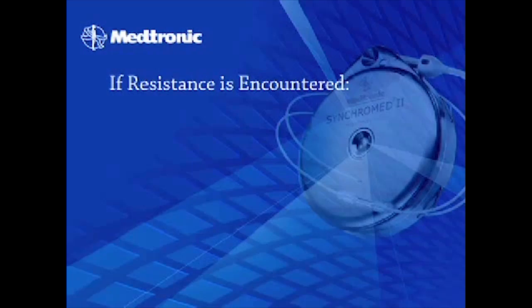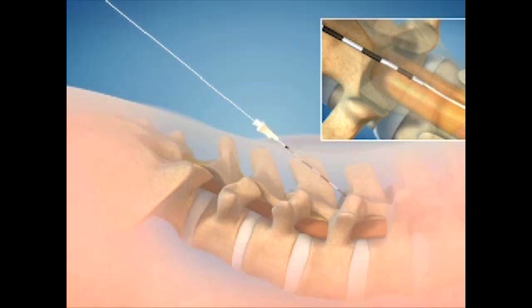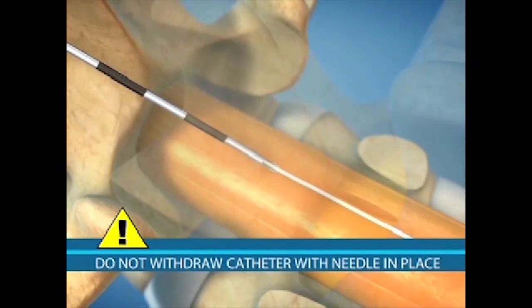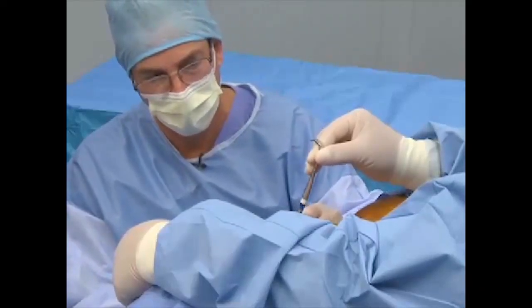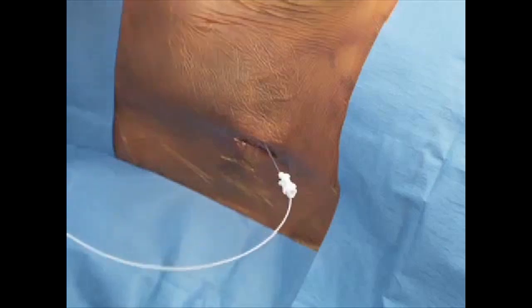If you encounter any resistance in advancing the catheter, try to reposition the patient, rotate the needle slightly, or change the needle depth or angle. If the catheter must be retracted during positioning, do not withdraw the catheter through the introducer needle. The needle tip can damage the catheter. Withdraw the introducer needle and catheter together. Then, carefully retract the catheter from the introducer needle and begin the procedure again.